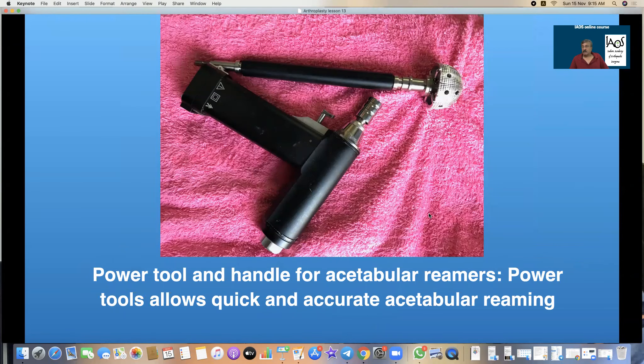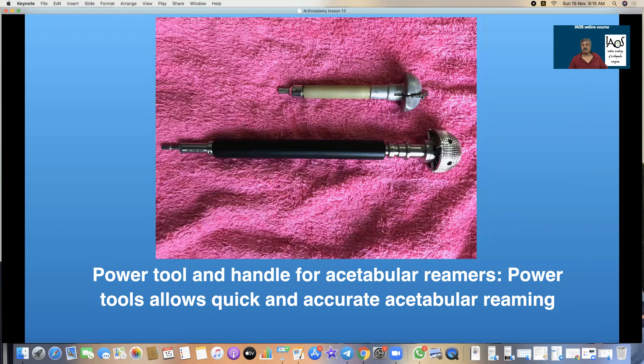That is a power tool and these are essential for reaming the acetabulum. In Charnley's time, he did not use power for his hip arthroplasty and he had a Hudson brace with which he would manually ream it and use a handle to make the anchorage holes. But with the availability of power tools, the job has become extremely simple and easy. Those are the detachable blade reamers and the diamond-tip reamers; the handle on which it goes then connects to a power tool.